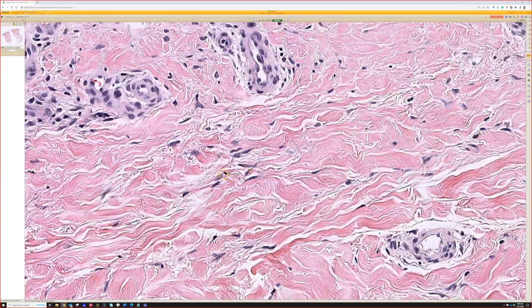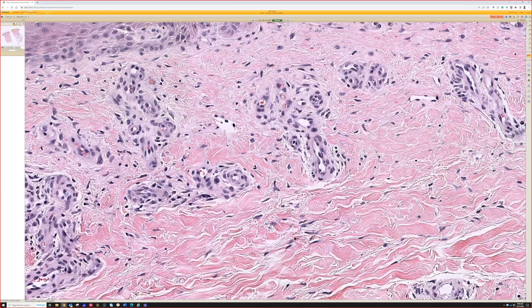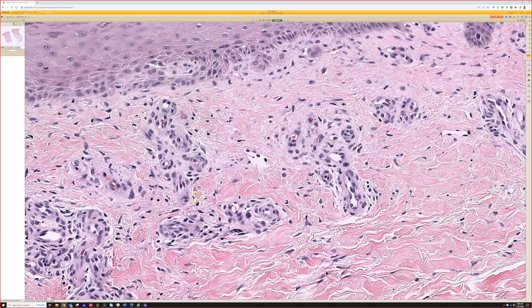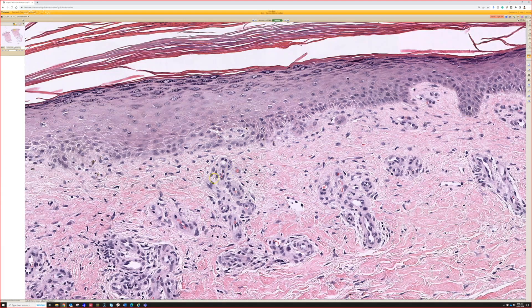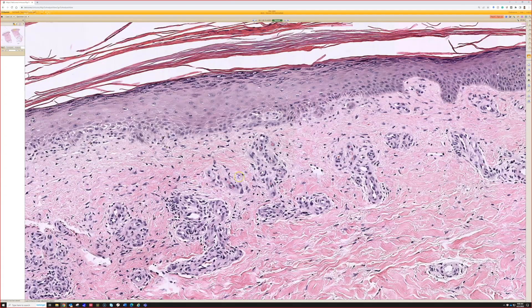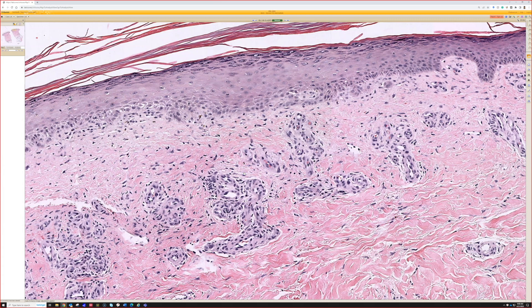And I like your point — there's some hemosiderin. Stasis change like this doesn't necessarily mean stasis dermatitis. A lot of times it's just an incidental finding. It's useful because it tells us we're dealing with the leg.